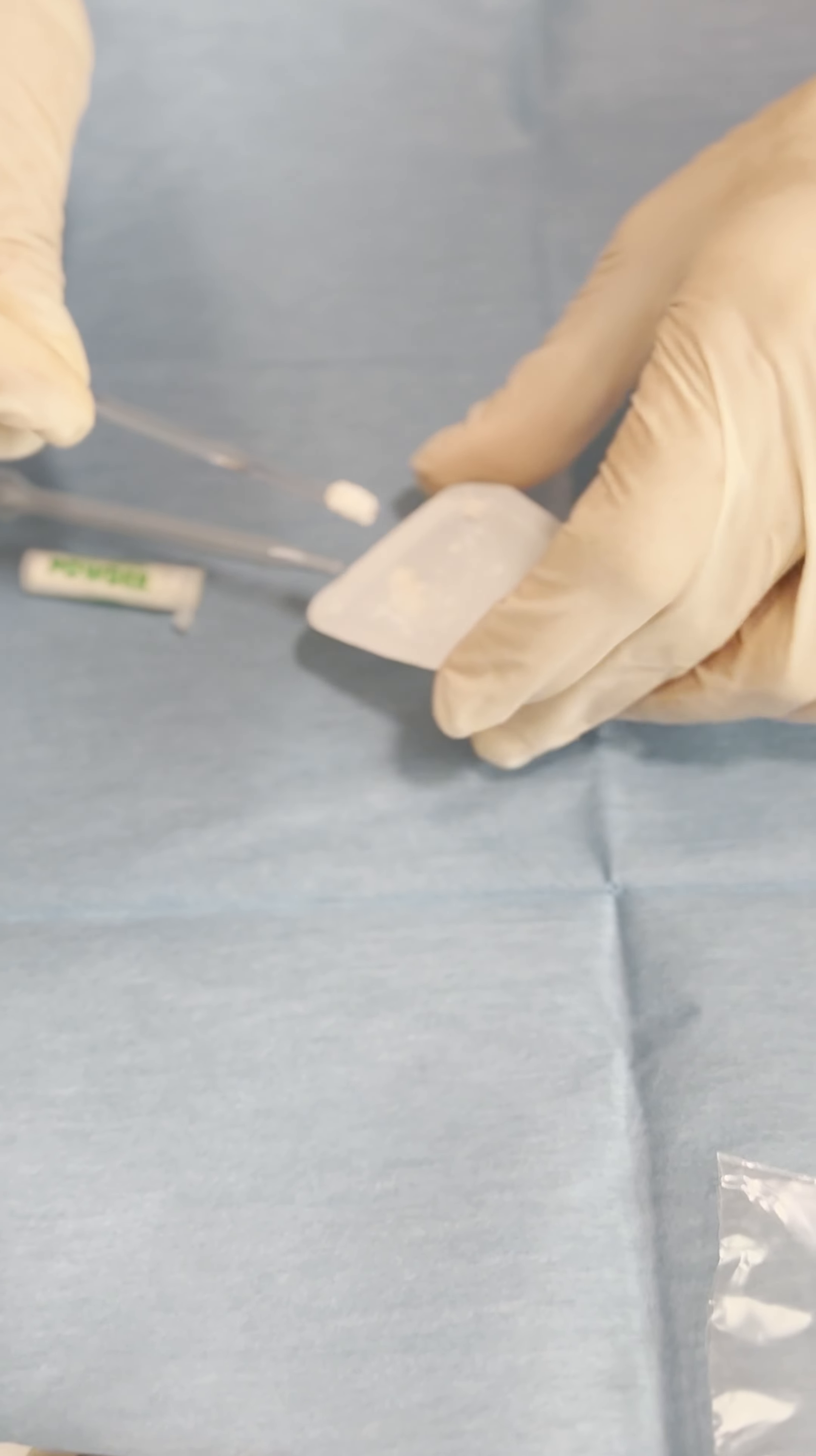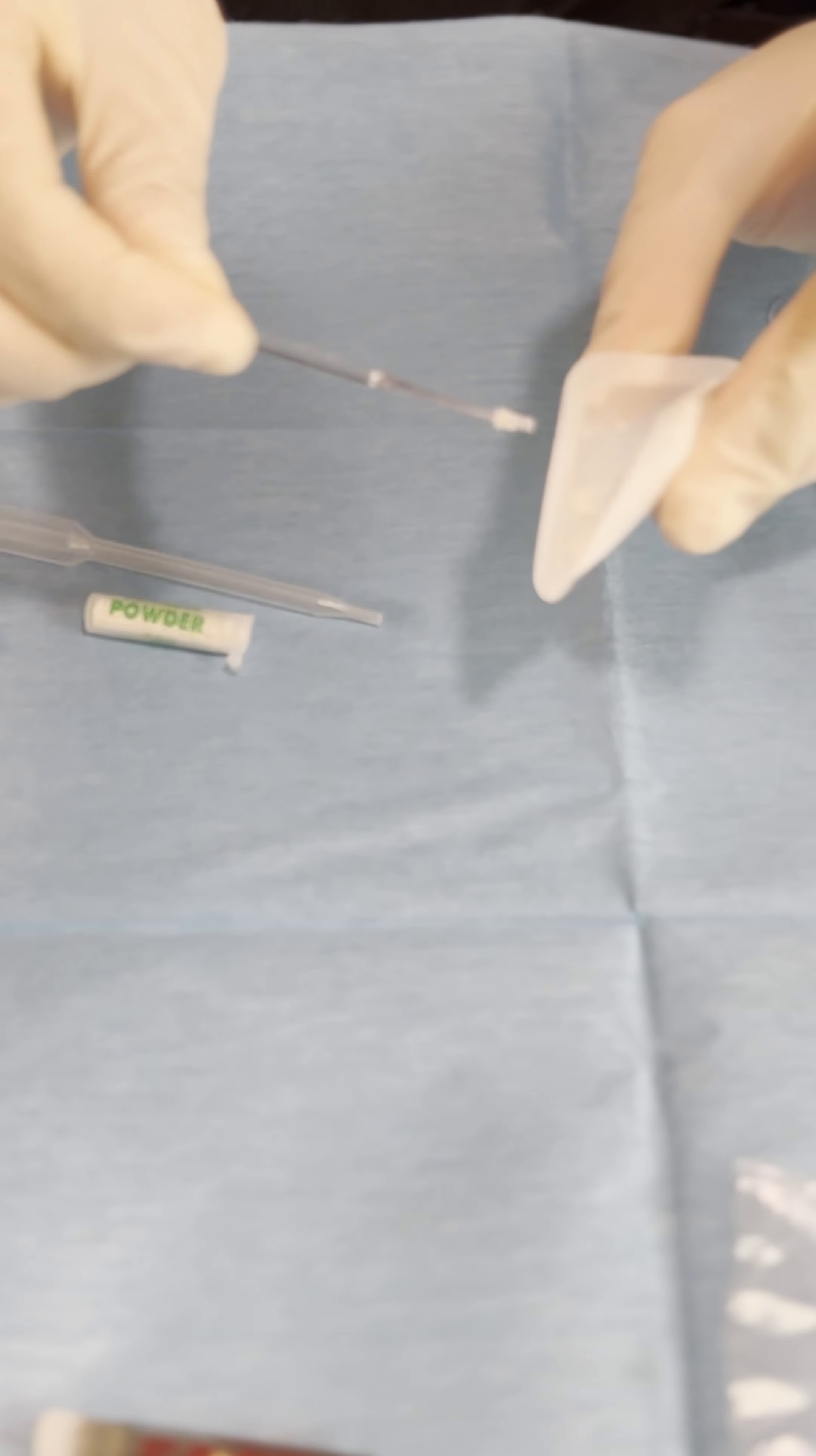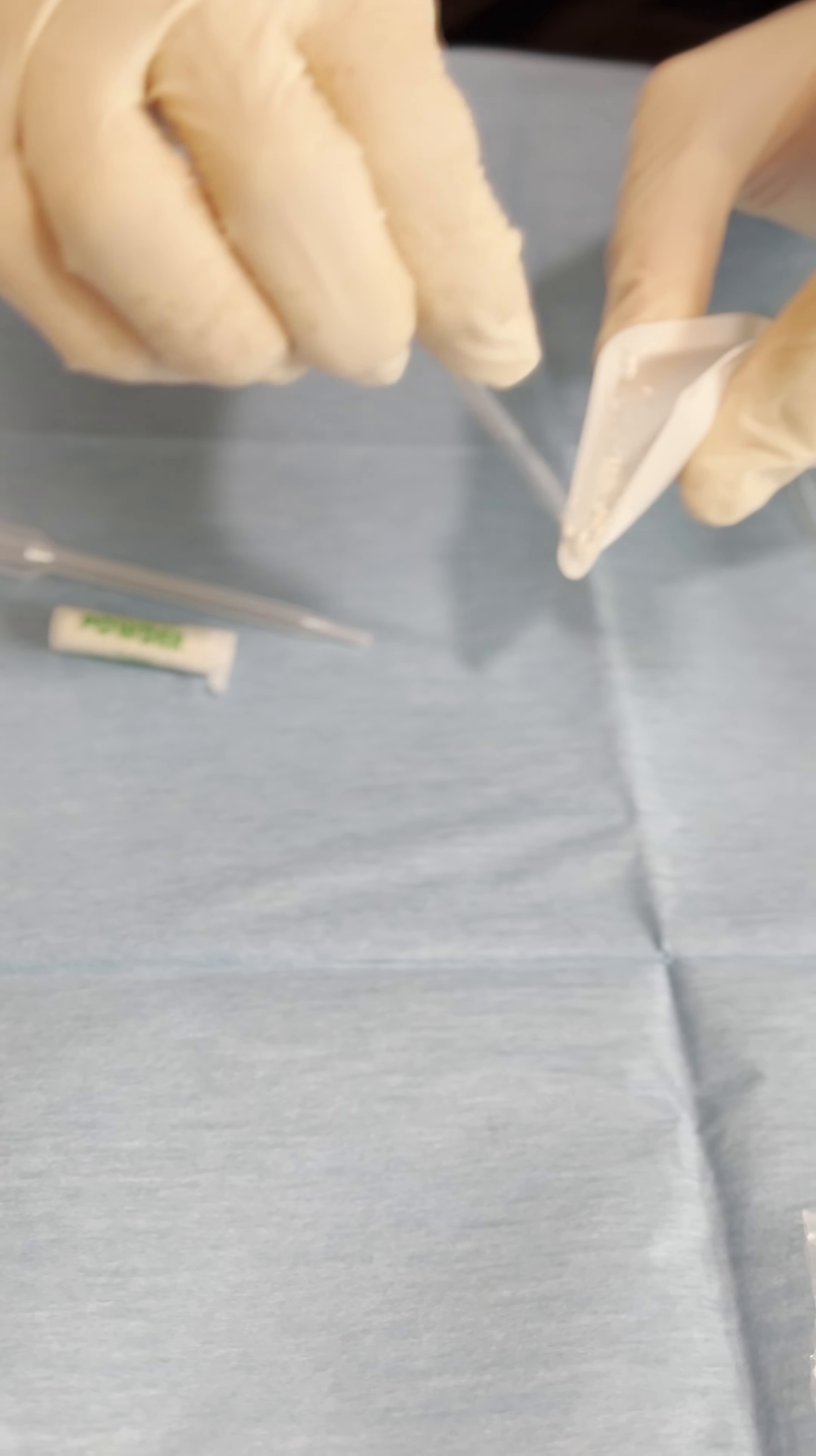In alternative, especially in the lower defect, remember that this is plastic and sterile so you can pour the material directly into the defect without having to move it around so you can drag it down and put it inside the defect.